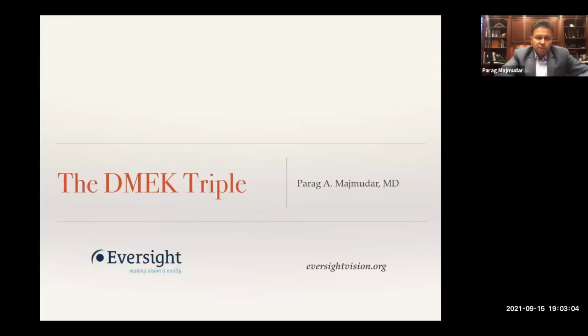But today they've asked me to talk about a concept where sometimes there's a little bit of uncertainty in terms of how to proceed. And that's when we have to combine DMEK surgery with cataract surgery. I am going to talk for about half an hour or so. We'll give you some ideas, tips, pearls. I'm going to go through a basically unedited video of a procedure, and I can highlight some areas where I think it might be helpful to make the transition from doing purely DMEK to doing DMEK plus cataract surgery.